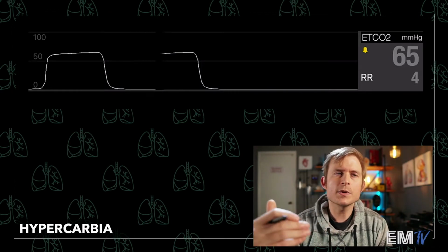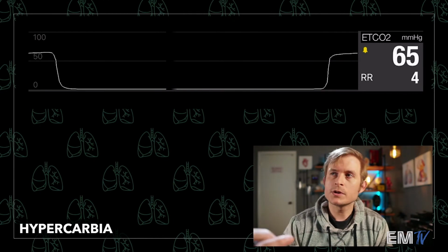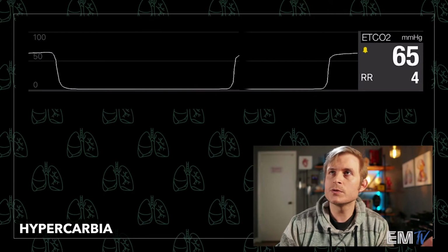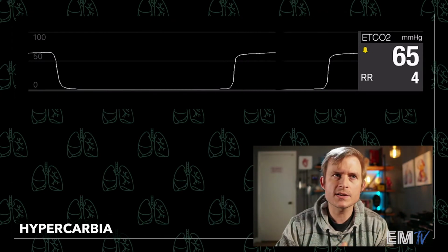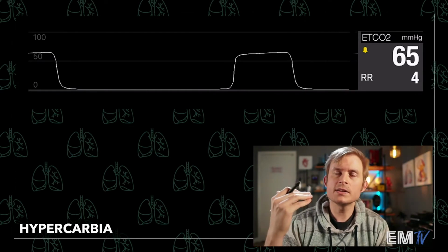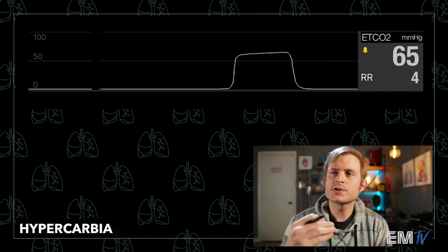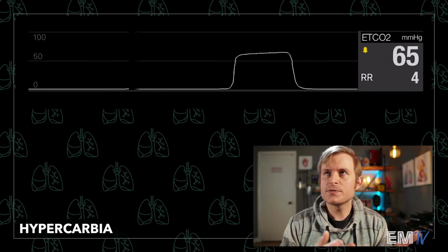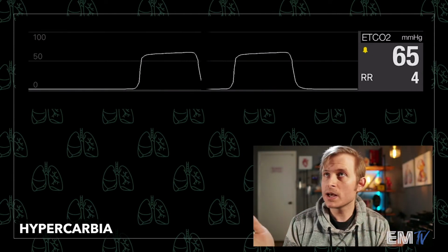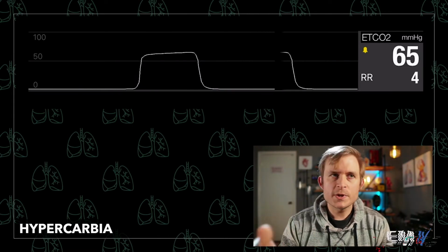In the case of a malignant hyperthermia, you would see normal respiratory rate and often a controlled respiratory rate because you are ventilating the patient, because it is assumed that you've given them some kind of paralytic or anesthetic gas, and you have a sudden significant increase in exhaled or expired end tidal CO2. When this occurs, we can recognize it very quickly on our capnography, on our capnogram, and we can take corrective action.